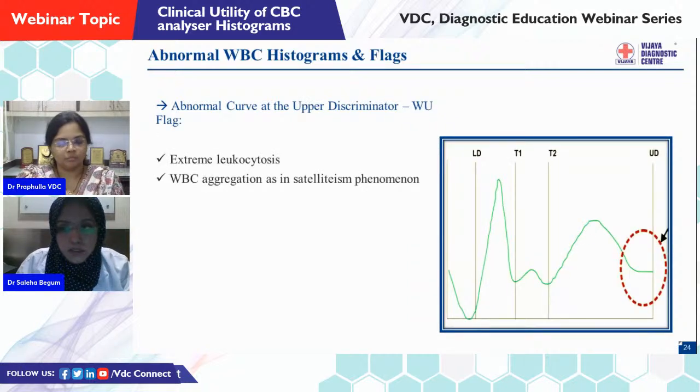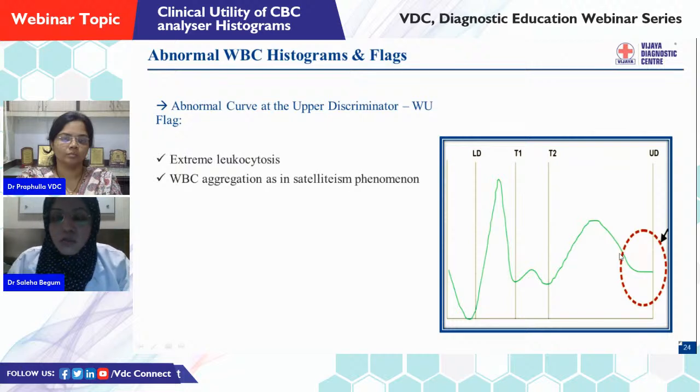This is a third variation where the graph is not ending at the baseline. Usually, a graph not ending at the baseline means there is some population which is larger than the neutrophils. But as we know, there is no population larger than neutrophils. So the causes for such an abrupt ending are extreme leukocytosis or WBC aggregation, as in the satellitism phenomenon. Sometimes the patient's neutrophils get into clumps in distribution, which is called the satellitism phenomenon, and that results in abrupt ending of the graph at the upper discriminator, indicating that some larger population is there, but eventually that larger population will be a false representation. Instead, the causes will be WBC aggregation or extreme leukocytosis.